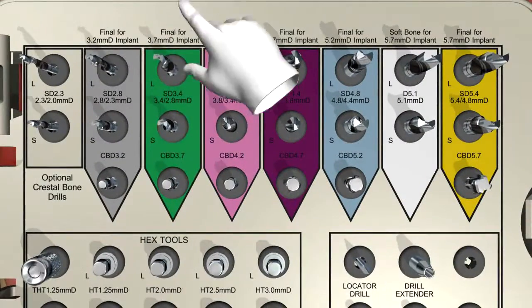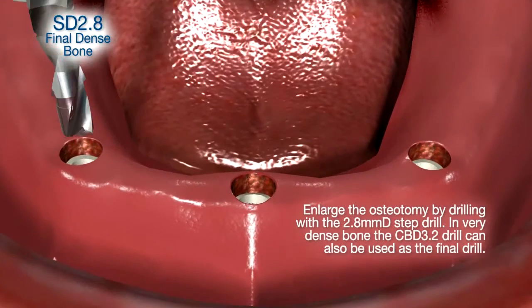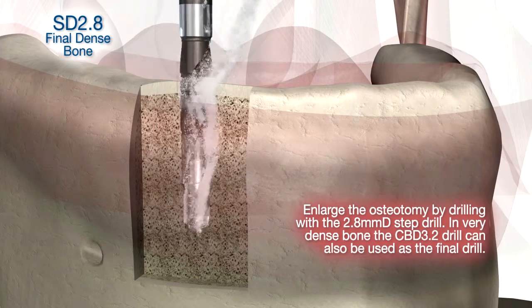If you now find out, though, that it is too dense to get it fully seated, then come back with the 2.8 drill and might as well penetrate to the full depth of the drill, to the 13 millimeter line.